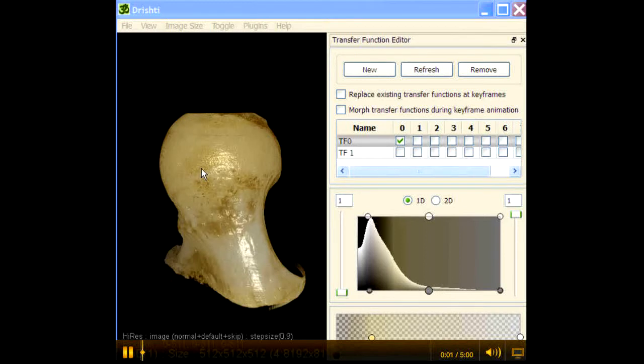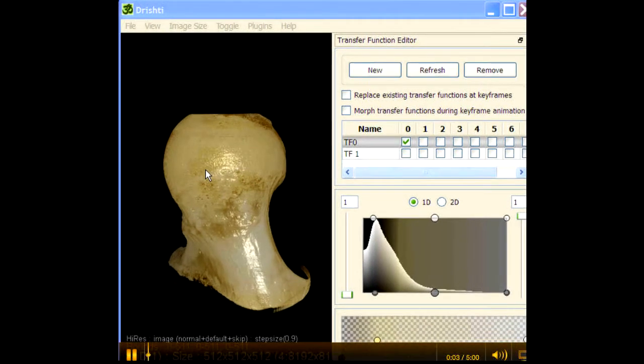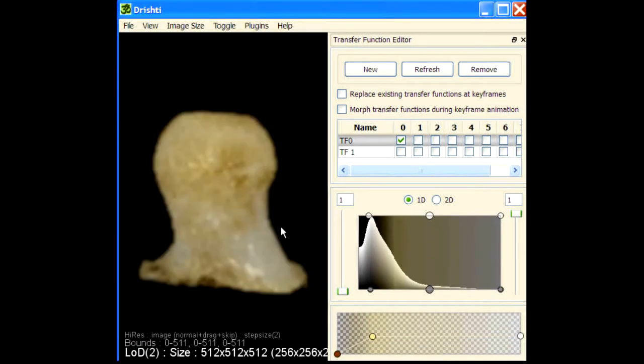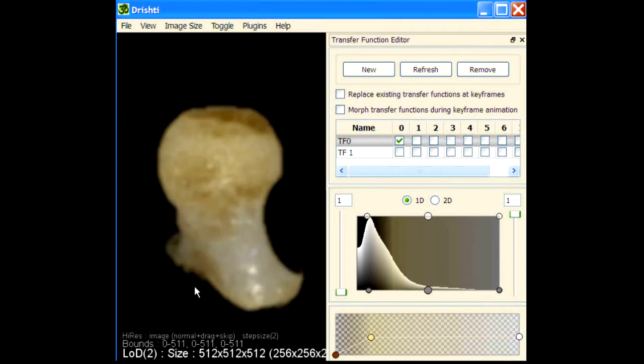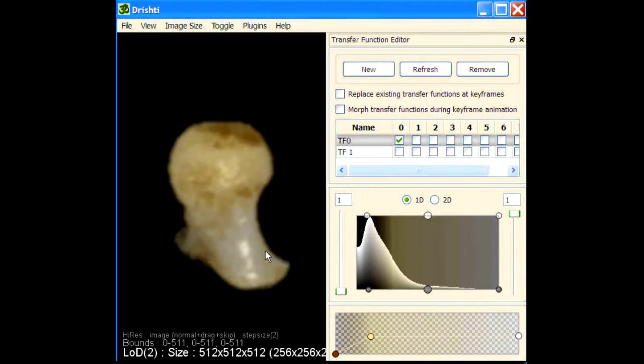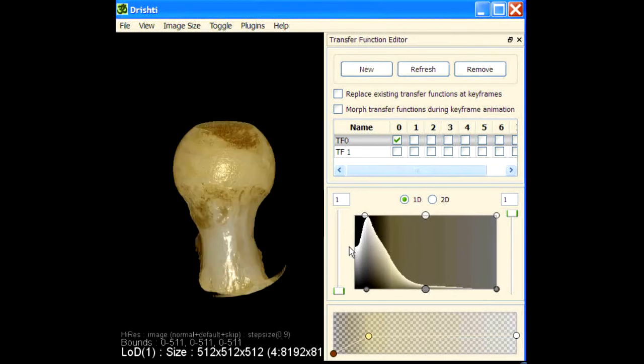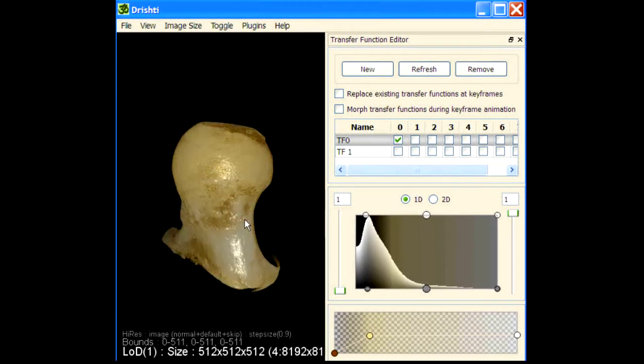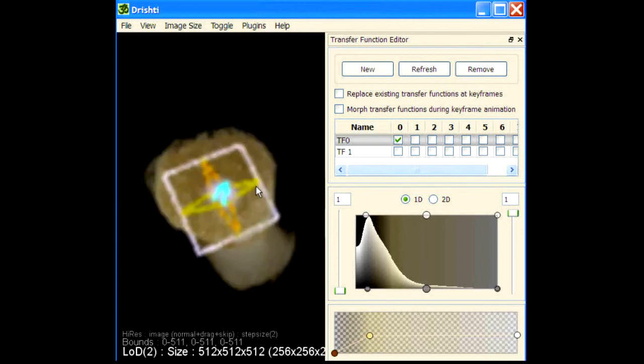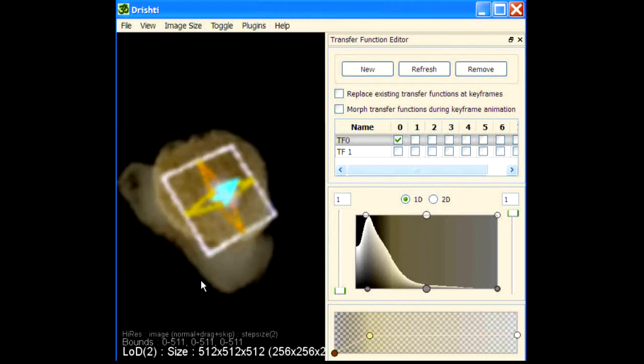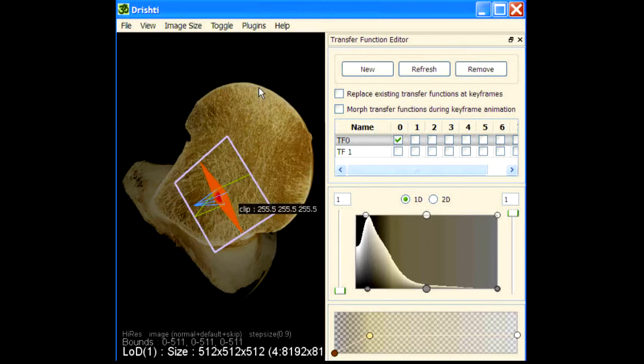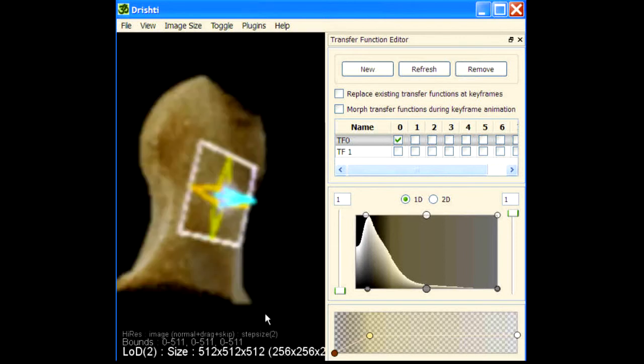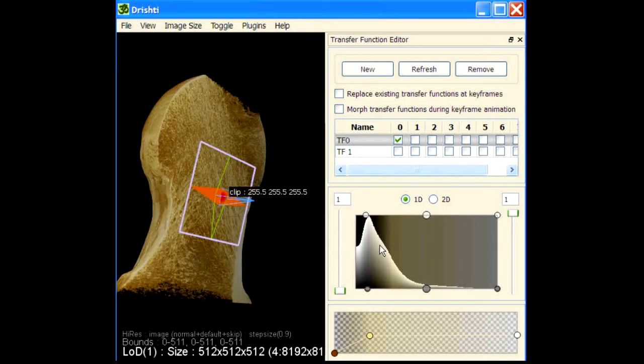This video will show how to get the thickness using the city block transform. Here again we have a hip bone and this is the transfer function that I have set. So this is the hip bone here and what I would like to know is to get the thickness based on the current transfer function.